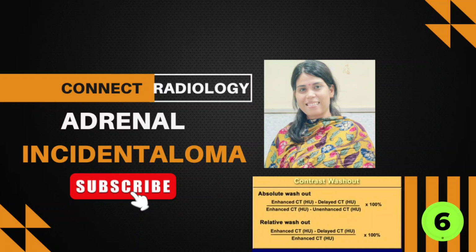So in this video we will discuss the rest of the things like washout CT protocol, chemical shift MR imaging, and a few of the adrenal pathology. So let's watch.